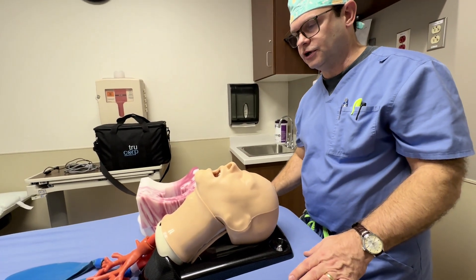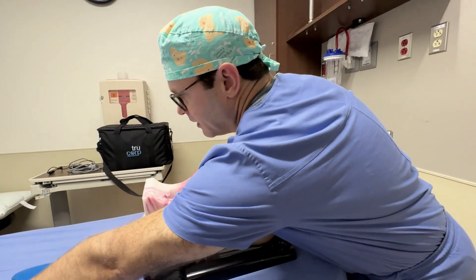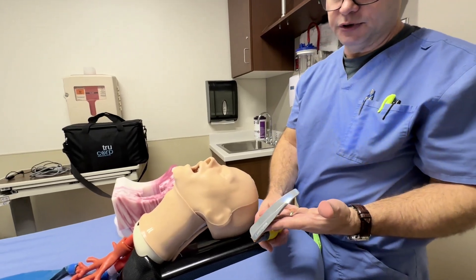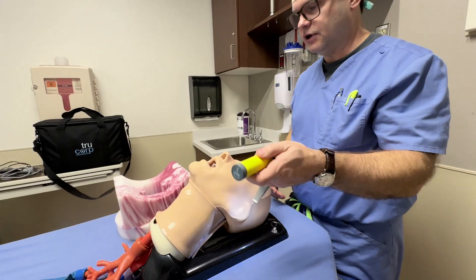Most of the conventional commercially available laryngoscopes are going to be designed for use by the operator's left hand, which is why, as we look here, we see that the light source is on the left, and it's designed to be used with the left hand.